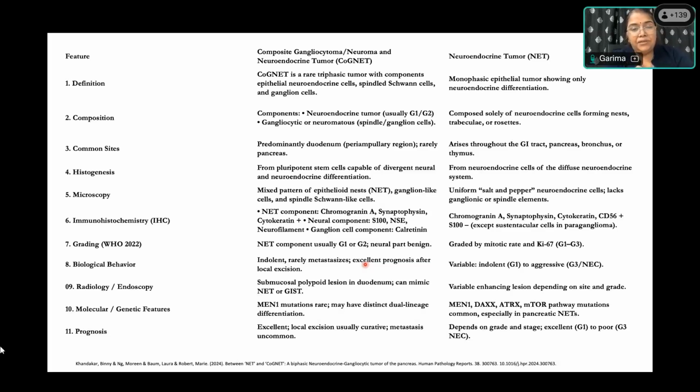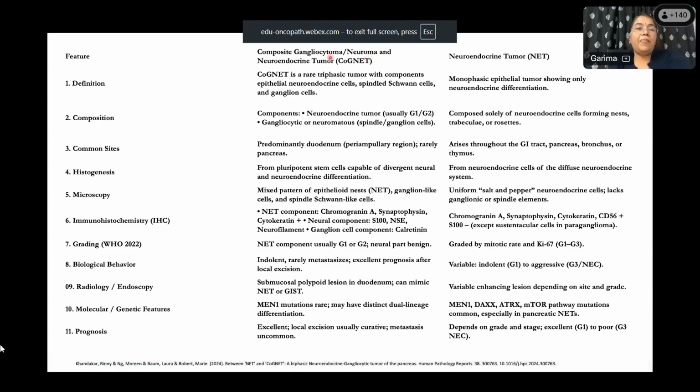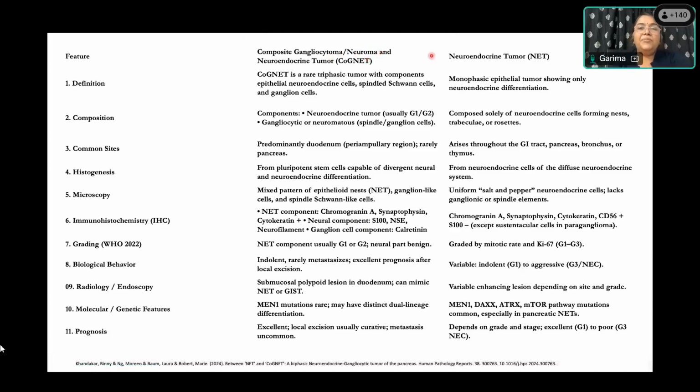The unique thing about this case was that though we found this tumor both in the pancreas as well as the duodenum, the epicenter was in the pancreas. This tumor was also involving the common bile duct, and the patient had dorsal agenesis of pancreas, so it became a unique case. Otherwise, this tumor is seen mainly in the duodenum. So first we thought that it is a neuroendocrine tumor, and it is probably having some perineural invasion.